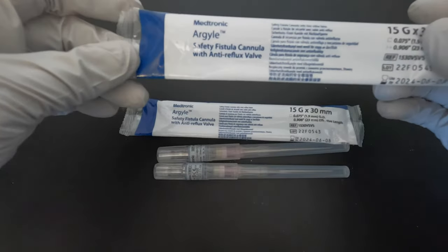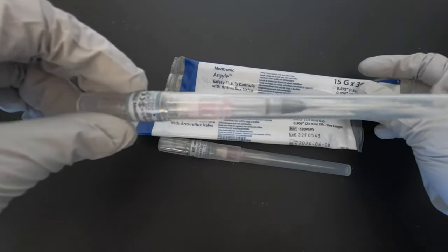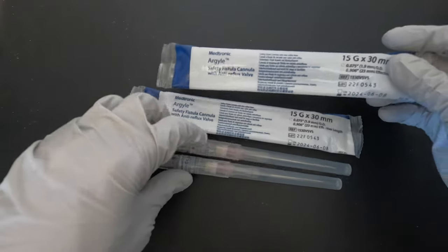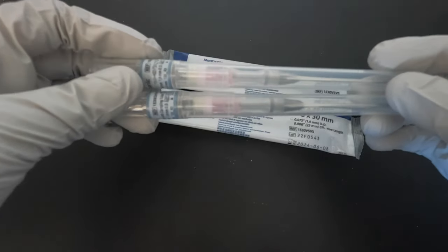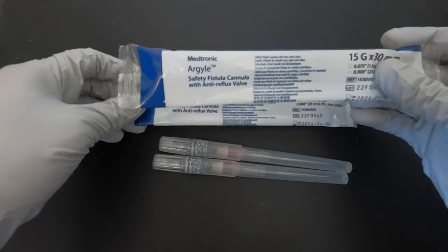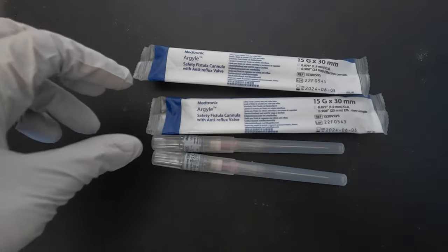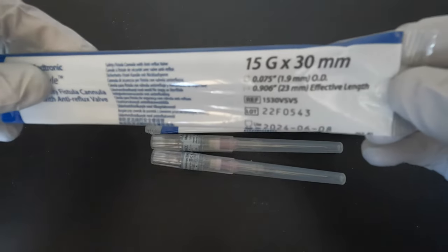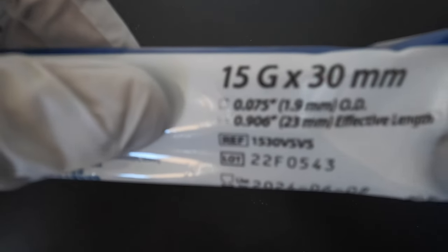We have two kinds of Argyle needles here: one with an anti-reflux valve and one without the reflux valve. The difference is that for the needle without the valve, you need a clamp when you take out the sharps, while with the anti-reflux valve you don't need a clamp. The one with the anti-reflux valve is more expensive.